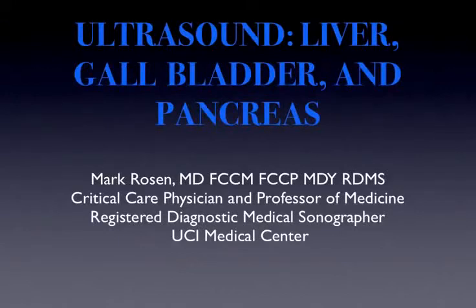CAT scan is the gold standard test for looking at the structure of the pancreas. The pancreas can be somewhat difficult to visualize, and you really need to know your landmarks. So when it comes to ultrasonography, gallbladder, the examination is crucial. Liver, super important. Pancreas, it's nice to know. But just realize that ultrasonography does have its limitations. But additionally, flip side, ultrasound can still be useful.